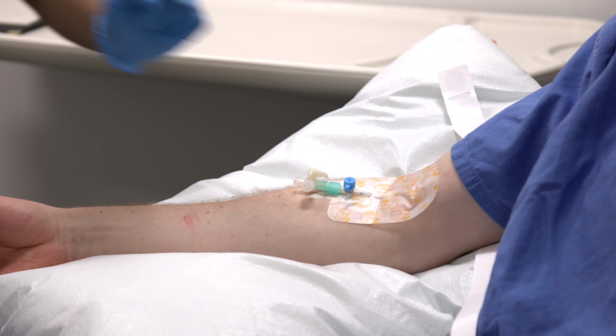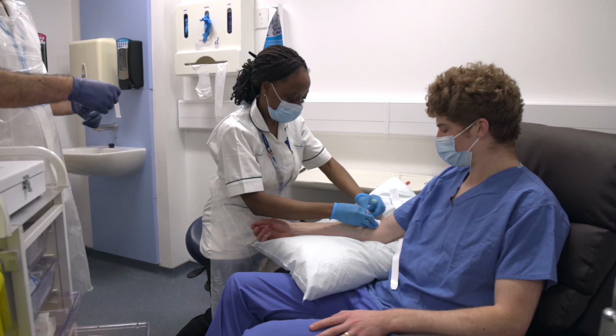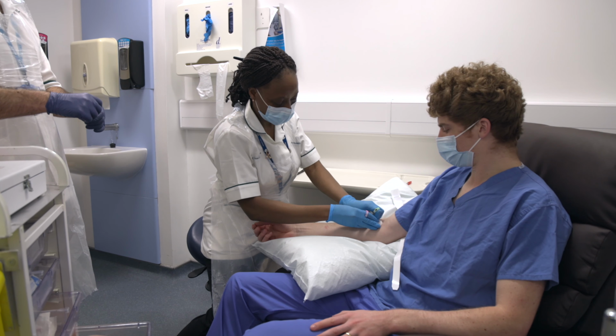We can use it to look at the brains of patients with dementia and look at how different parts of the brain uptake sugar. If some parts take up less than you'd expect, that might be because there's problems with that bit of the brain in that patient. We can also use it to look at the hearts of patients that we suspect might have problems. If part of your heart doesn't take up any sugar, then that means that bit of the heart is either dead or it's not getting any blood and sugar supply, and so it soon will be. And this is important information to help us decide what we need to do to treat and look after our patient.